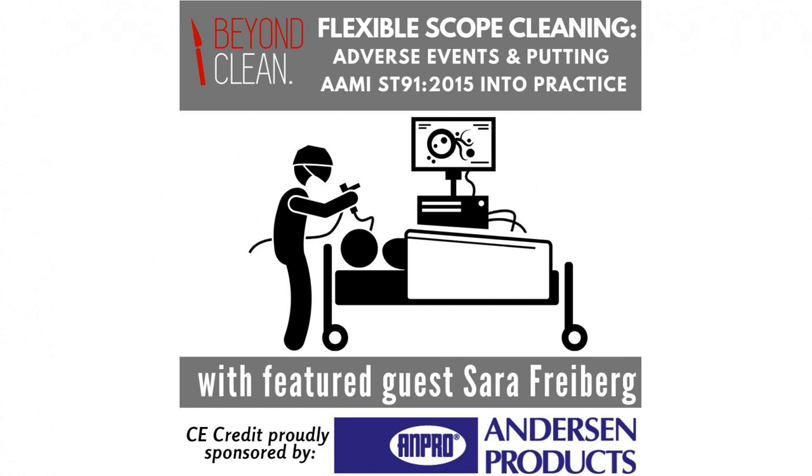And once these steps are completed, we recommend users follow their specific hospital protocol, which may entail marking the damaged area carefully with a colored electrical tape, being cautious not to wrap too tightly to avoid any additional damage to that scope, contacting their supervisor and confirming with their specific scope manufacturer prior to sending it for repair. If the scope has significant damage where the scope will not stay pressurized, we always recommend facilities confirm with their specific scope manufacturer prior to sending in for repair.